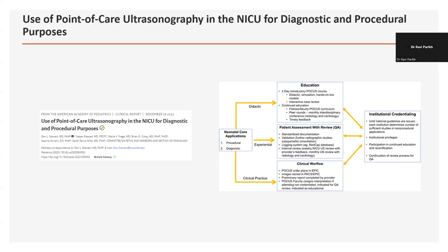Because if you have somebody then doing a lung ultrasound and he doesn't have a report, then he doesn't know what interpretation you've made, what your clinical correlation is, why you've taken the decisions you have. But more importantly, that's not there on the radiology system. And that can create a lot of problems in different countries. In particular, in the UK, I know that the standard process is reporting within 48 hours, in at least my institution where I used to work.